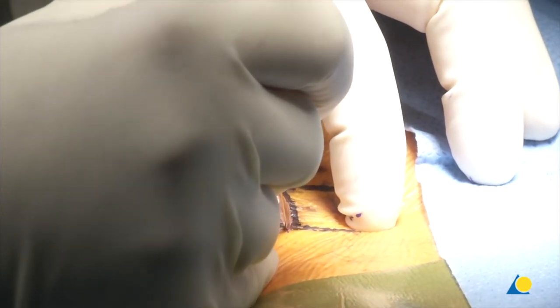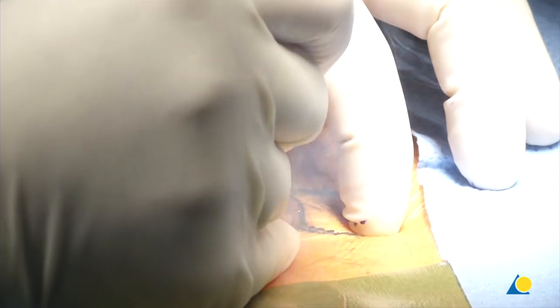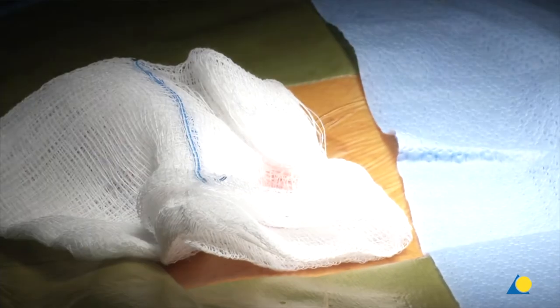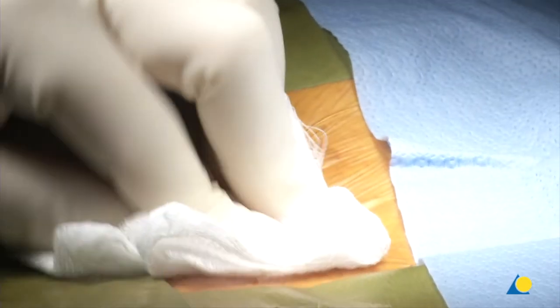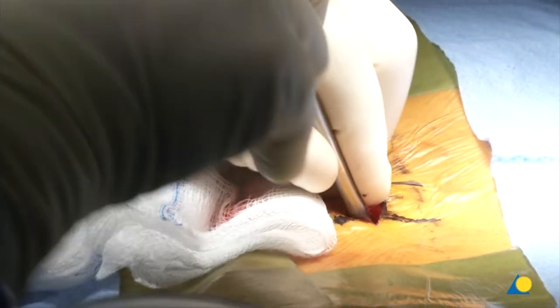I use the cutting mode on the bovie to make that incision, go down, then knife back, and we go through the fascia with the knife to make a fascial incision. Then I use the first dilator and go down through the fascia. From our x-ray I know I probably have to go a little bit north.